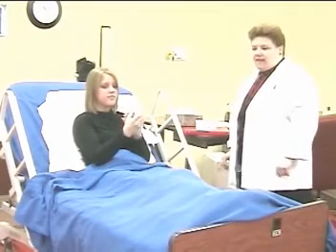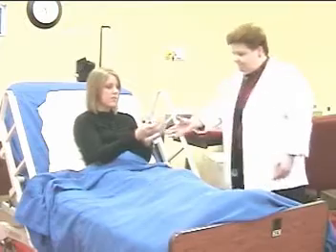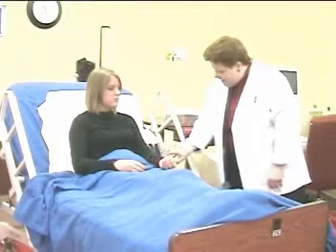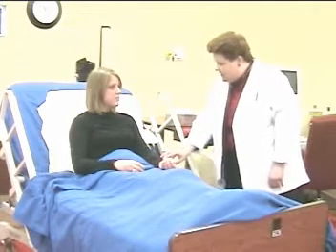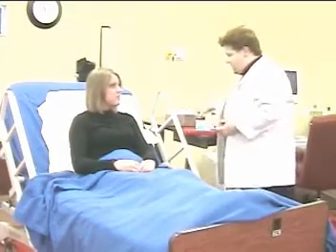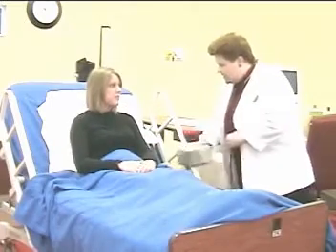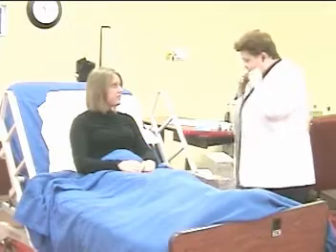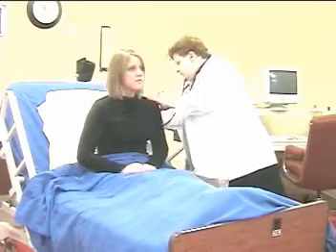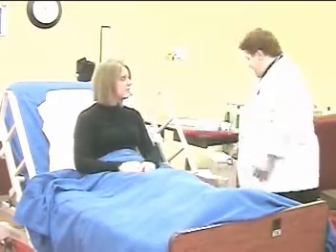Once the patient is done with the spacer and medication treatment, the therapist monitors heart rate, respiratory rate, and breath sounds at the end of delivery. Can I count your pulse again, please? Counting respiratory rate. Will you take a nice deep breath for me and cough, please? Do you need a Kleenex? Can I please listen to your lungs one more time? Can I have you sit forward? Thank you. Nice deep breaths. You can sit back now. Thank you.